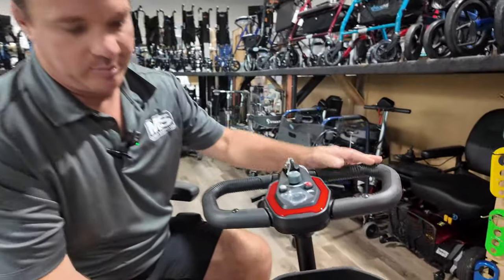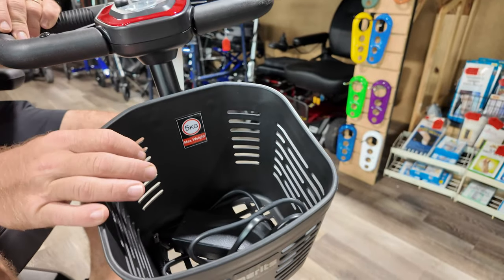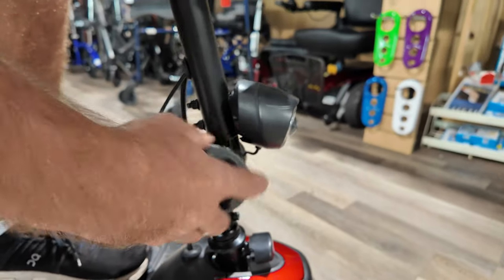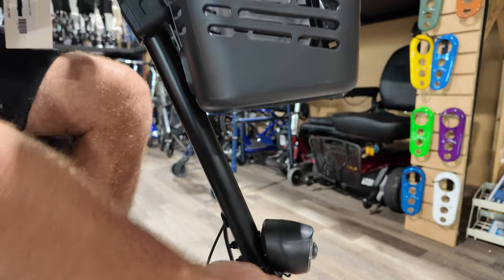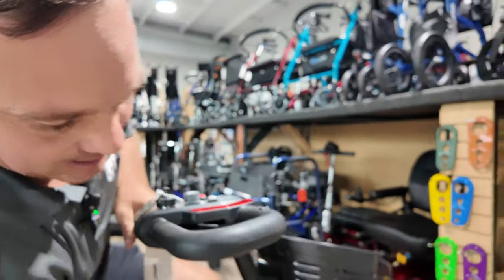The basket is not very big — it's small, similar to baskets on a lot of smaller scooters. This is your adjustable tiller; it can move back and forth toward you and you can lock it into place. Just make sure the grooves get back in there.